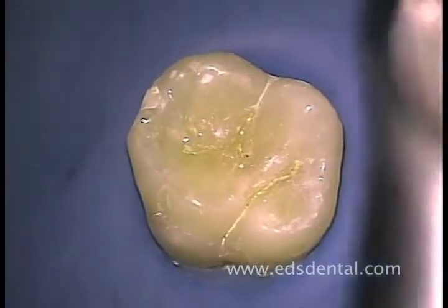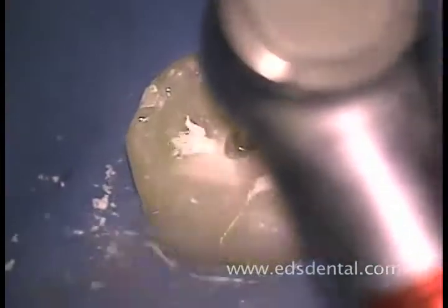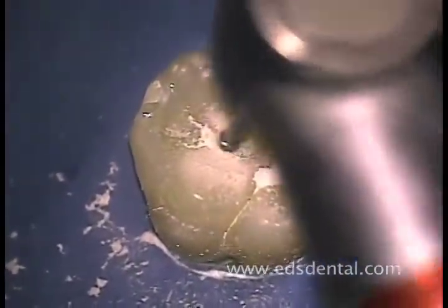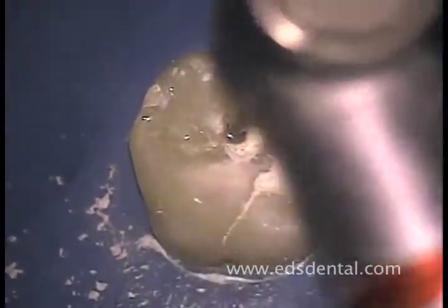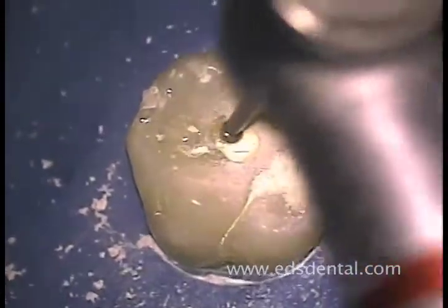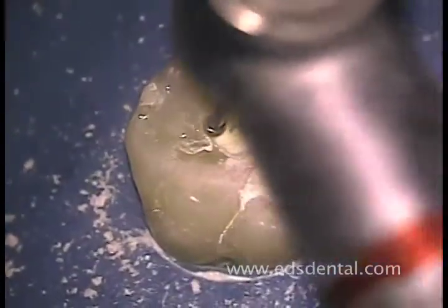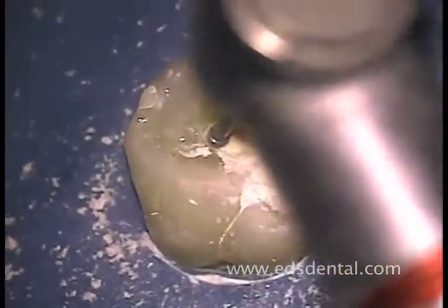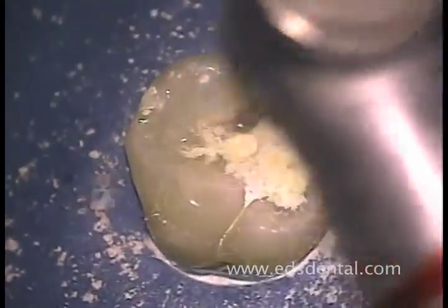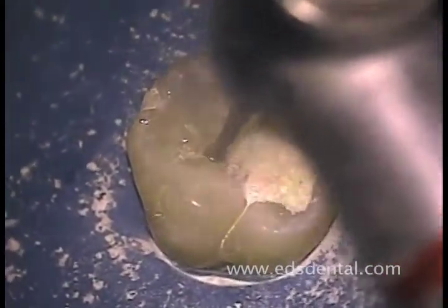I make my initial opening into the pulp chamber using a high-speed No. 4 surgical length round burr. The burr is placed more or less into the central fossa of the tooth. I will be making a triangular opening with the mesial buccal angle under the mesial buccal cusp, the distal buccal angle close to the central fossa.